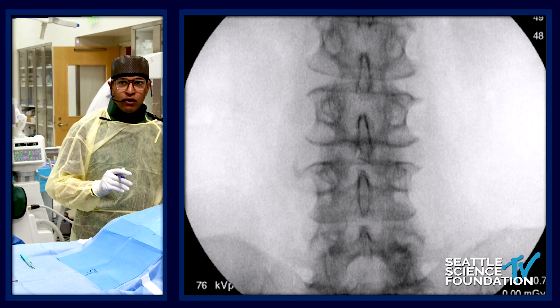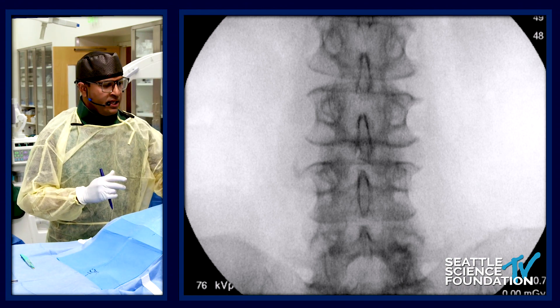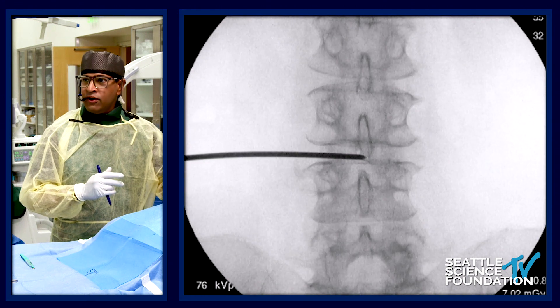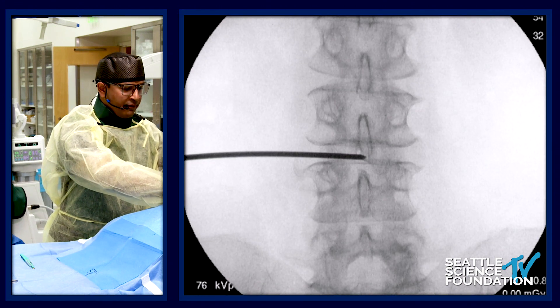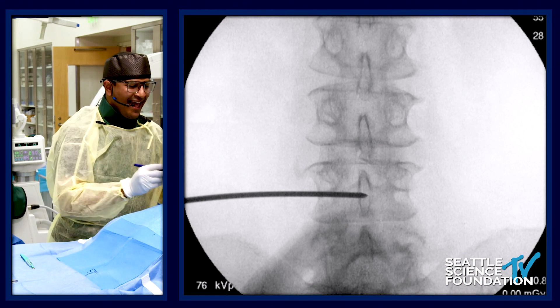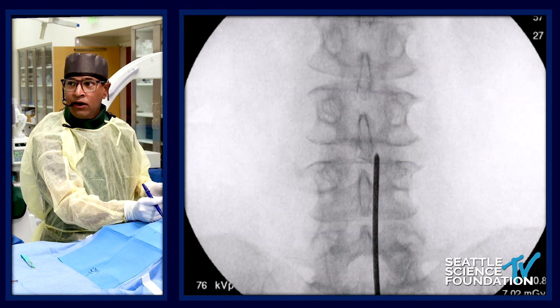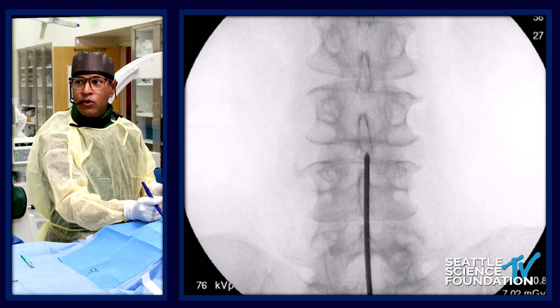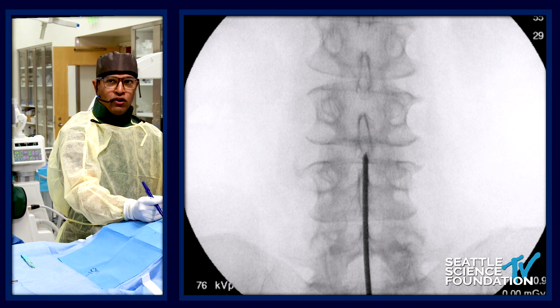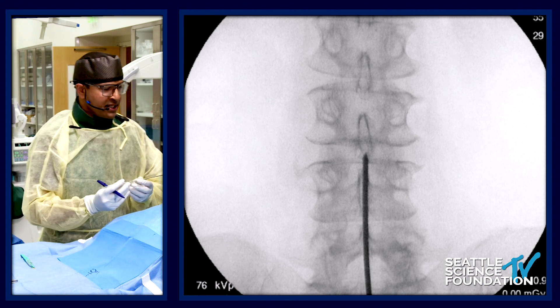Obviously we'd have imaging to support the diagnosis. This is indicated on label for moderate spinal stenosis — neuroforaminal, lateral recess, or central canal. I take a pointer and start right at the very bottom tip of the L3 spinous process, put a dot there, then go 1.5 centimeters down. If your incision is off midline at all, you'll favor one side due to the supraspinous and interspinous ligaments. Drawing a midline line ensures your incision is right down the middle.